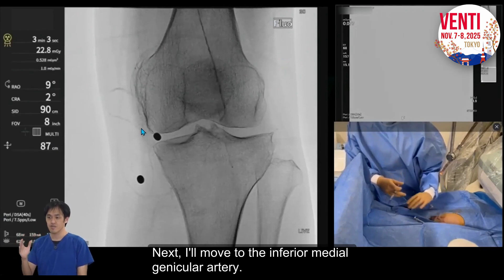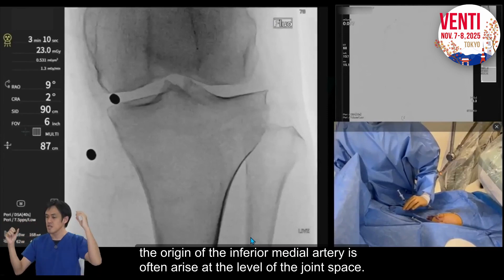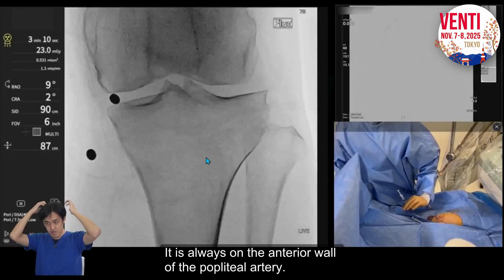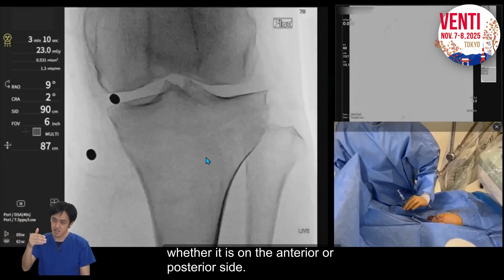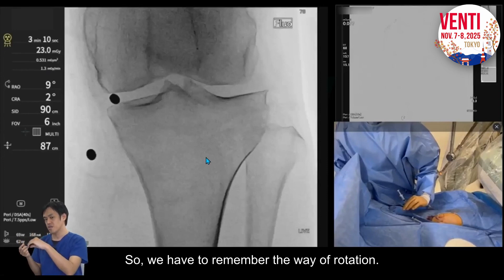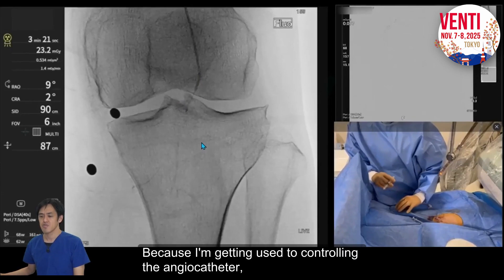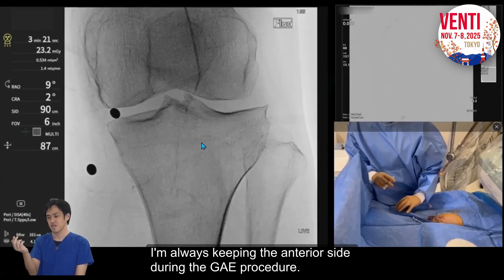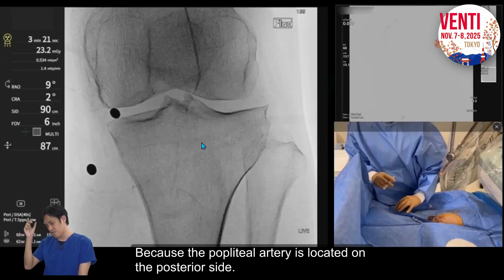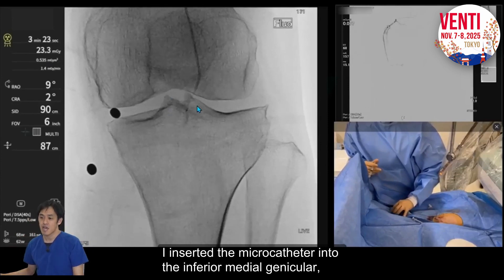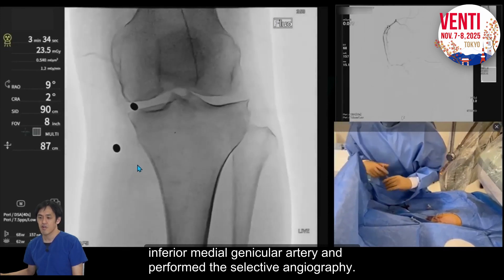Next I move to the inferior medial genicular artery. The origin of the inferior medial is often at the level of the joint space, always from the anterior wall of the popliteal artery. We have to control the angiocatheter to the anterior side. Because this is an AP view, we cannot distinguish anterior from posterior, so we have to remember the rotation. Every genicular artery arises from the anterior wall of the popliteal artery because the popliteal artery is located posteriorly. I inserted the micro catheter into the inferior medial genicular artery and performed selective angiography.